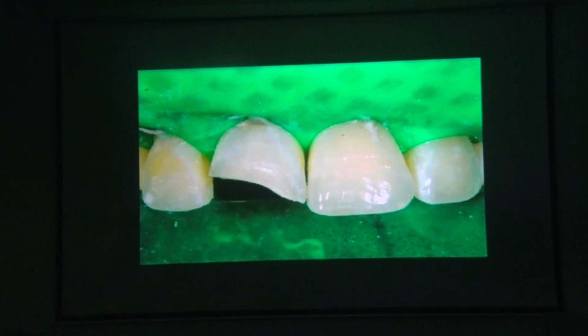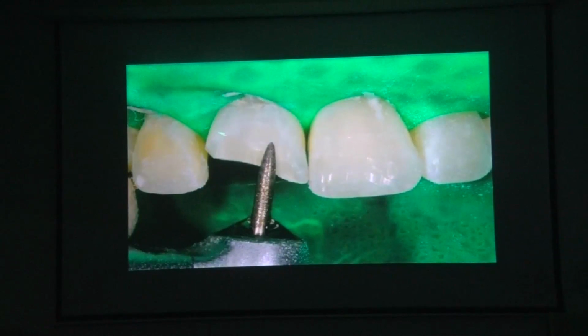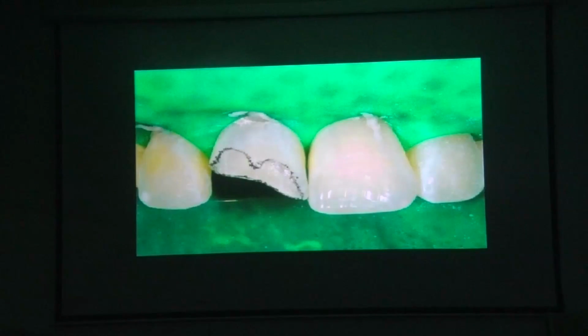Because I can perceive whatever is straight, but I cannot perceive whatever is up and down. And that is a simple thing you have to do in your practice. So always take a needle burr, always use a diamond, and then give a scalloped bevel over the long bevel. So you break that straight line into a curved line. That's the simple logic. Now when you do that, nobody can tell where the line is. And please believe me, it works.